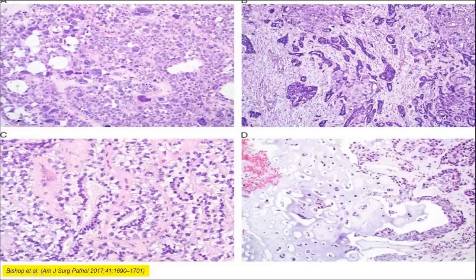And then a few other panels from their publication are these very pleomorphic carcinomas, and this one that looked like an epithelial-myoepithelial carcinoma, and then some carcinomas that had clear cartilaginous differentiation. So a whole varied histology that you can see. The majority that I have seen so far have more of the adenoid cystic or the basaloid type morphology, but just be aware that you can see some of these other types of histologies.